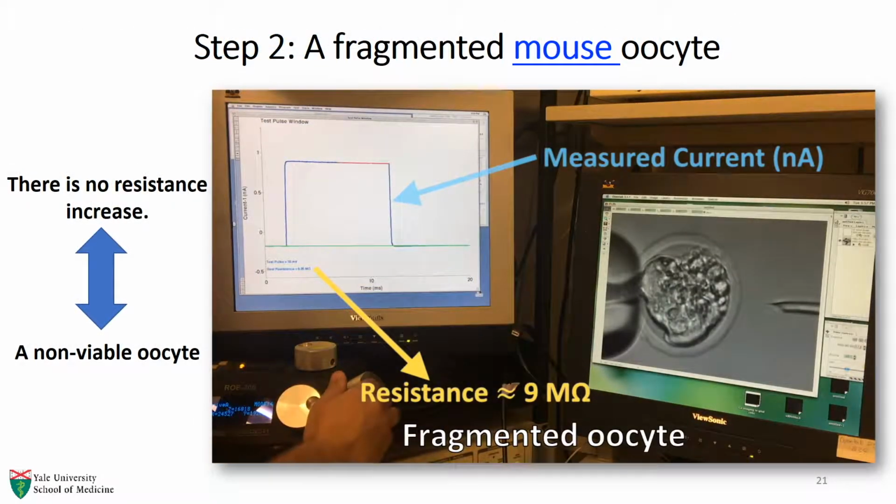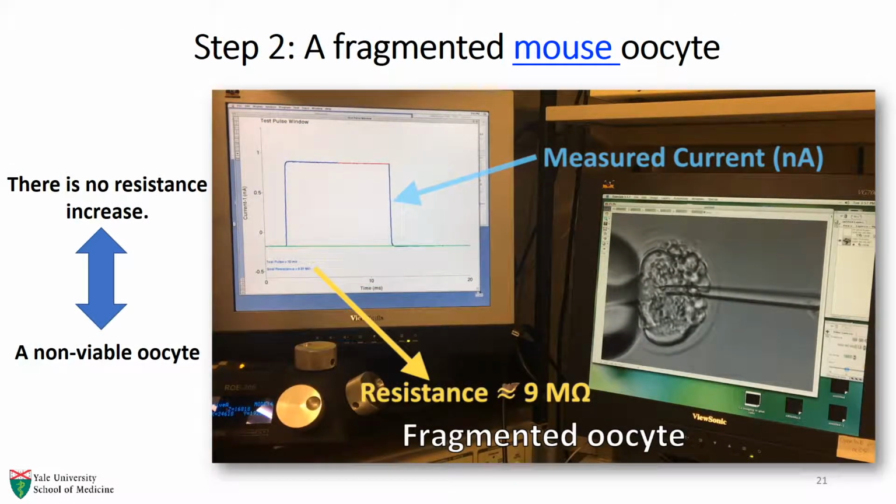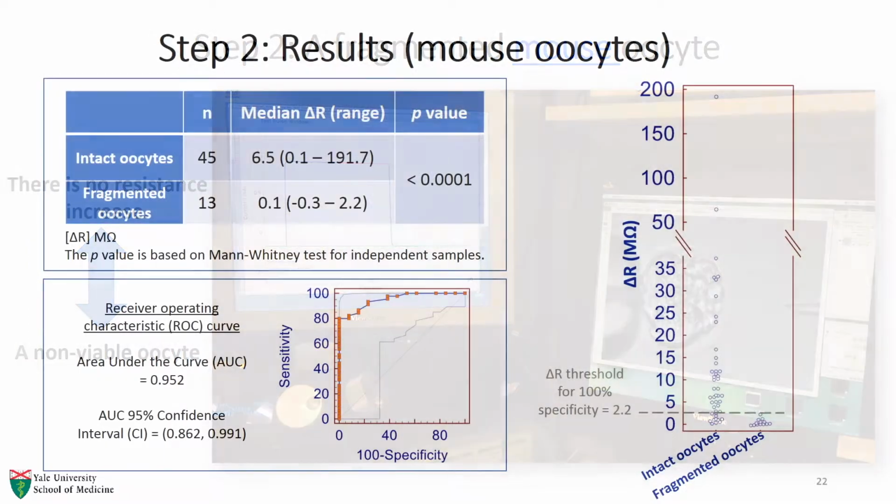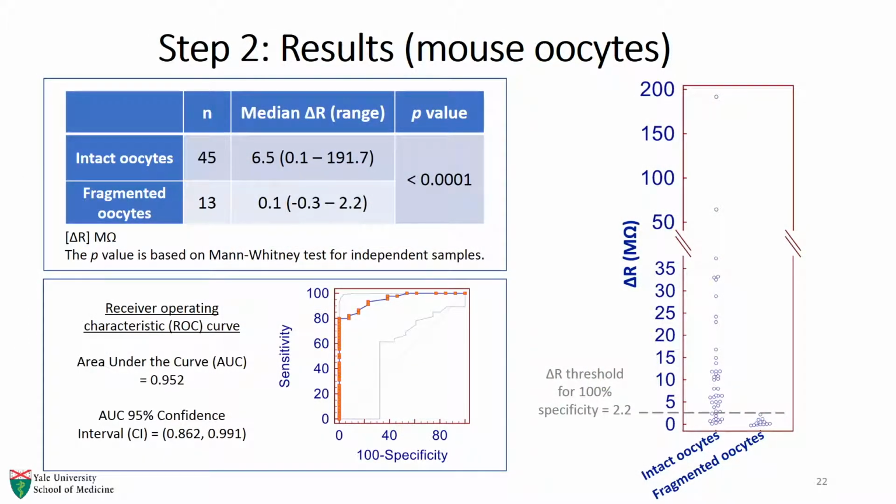A fragmented oocyte is never viable and therefore will not show a significant resistance increase as shown here. In this experiment, the fragmented mouse oocytes showed a resistance increase of up to 2.2 megohms, and there was a significantly higher resistance increase in the oocytes with the visually intact oolemma.